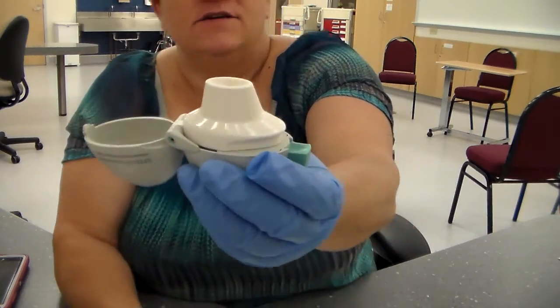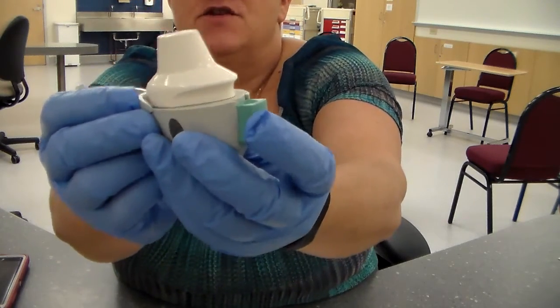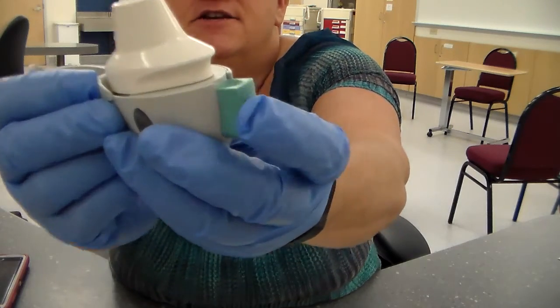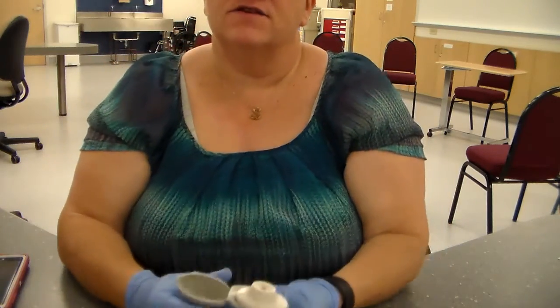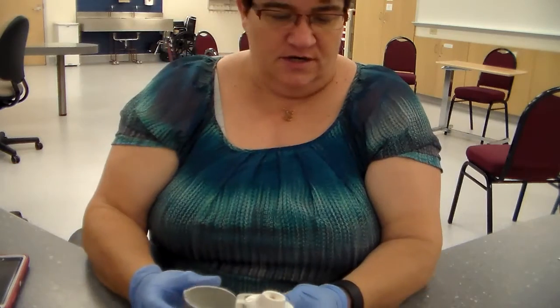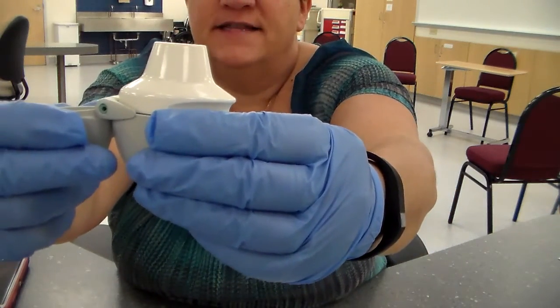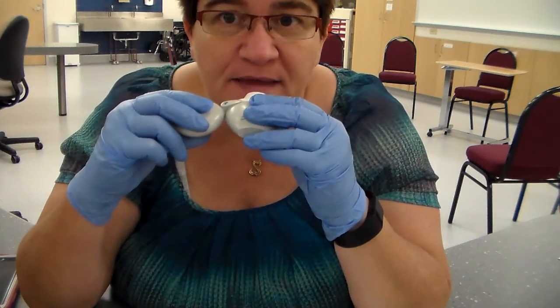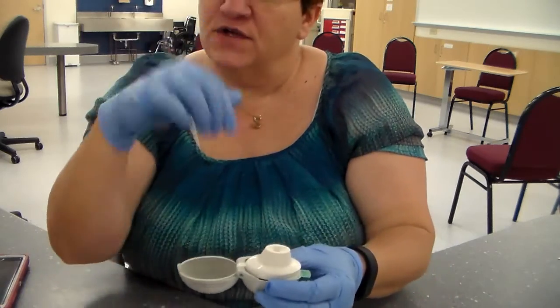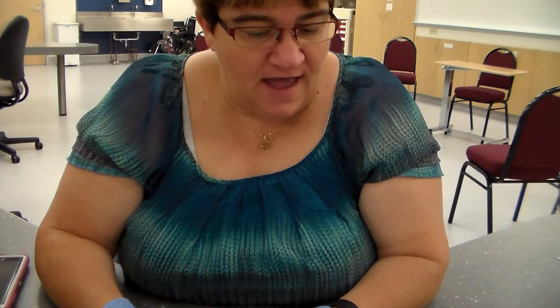And then it's still not ready to give to the patient. You want to make sure that you pierce it. So you push this green thing. Did you hear that? It's going to sound like that. You're going to pierce that medication. And then you want to have them hold on to it just like this, or they can hold on to it with both hands like this. And they're going to put their mouth around that piece, with their lips around it really tight. And then you're going to have them breathe out completely.